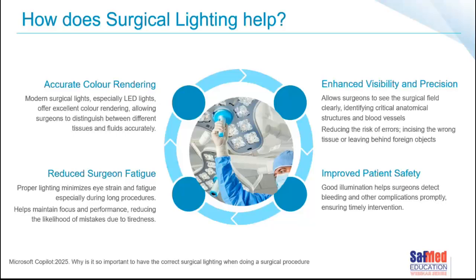It helps the surgeons detect bleeding or any other potential complications promptly, ensuring timely intervention. Fatigue is a very important aspect when it comes to lighting, and proper lighting minimizes the eye strain and the fatigue, especially during long procedures. It helps maintain focus and performance, of course, once again reducing the likelihood of mistakes.